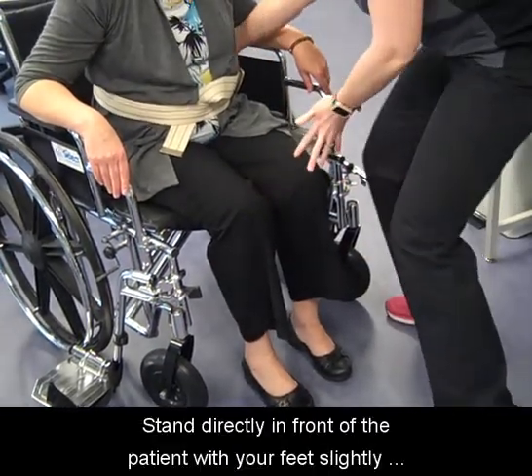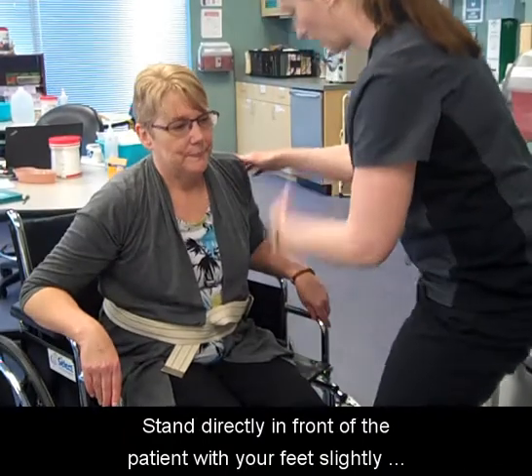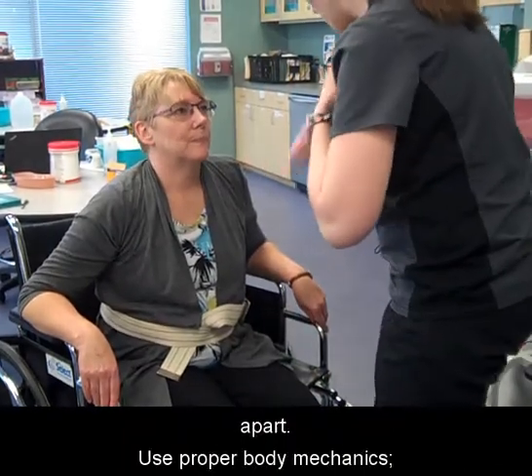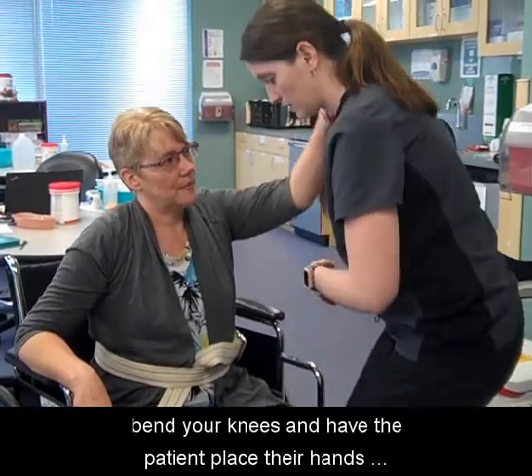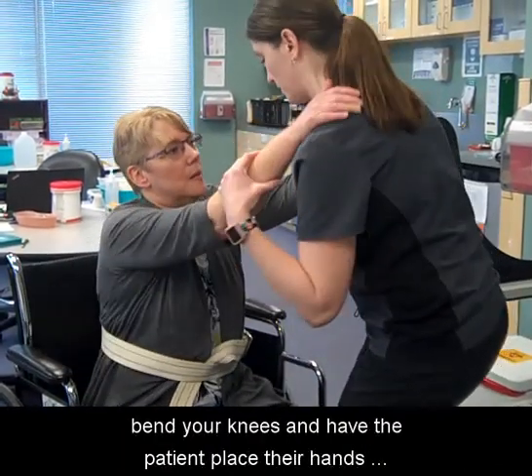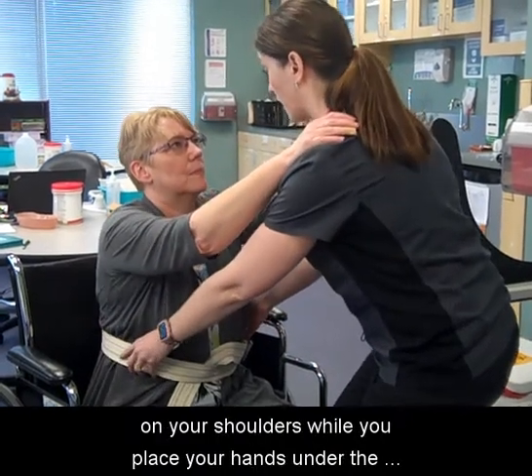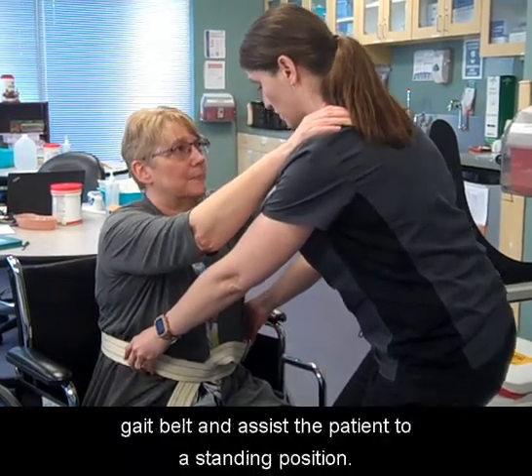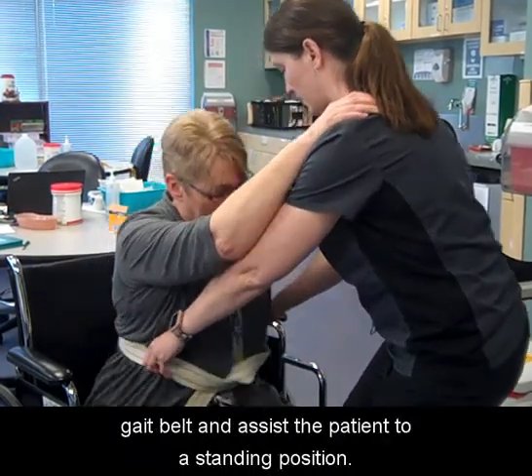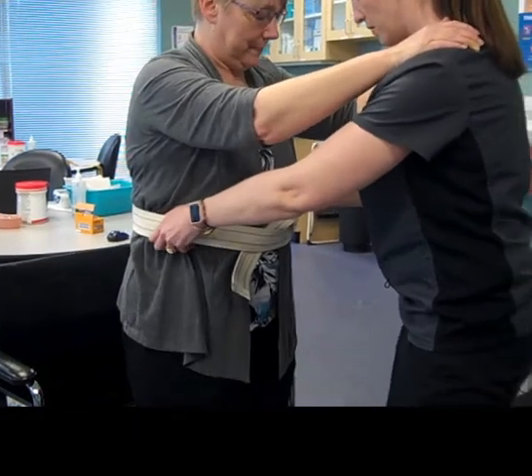Stand directly in front of the patient with your feet slightly apart. Use proper body mechanics. Bend your knees and have the patient place their hands on your shoulders while you place your hands under the gait belt and assist the patient to a standing position.